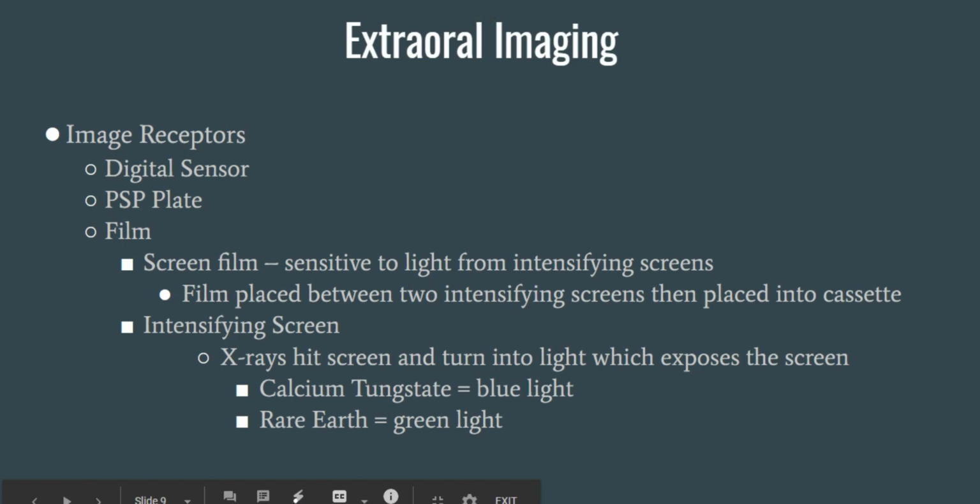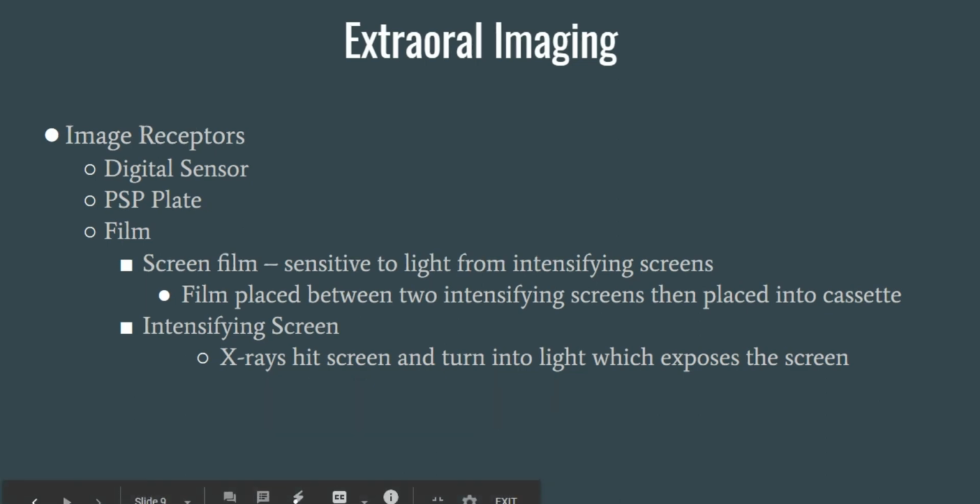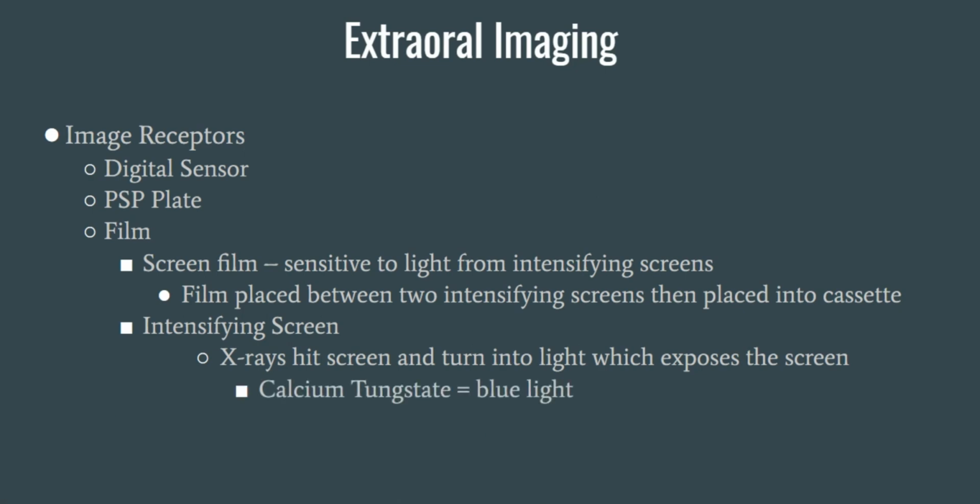I'm going to back up and do the intensifying screen, calcium tungstate and rare earth again. I don't quite like the wording that I think I used, so I'm going to back up and do those again. Okay, let's try this again.